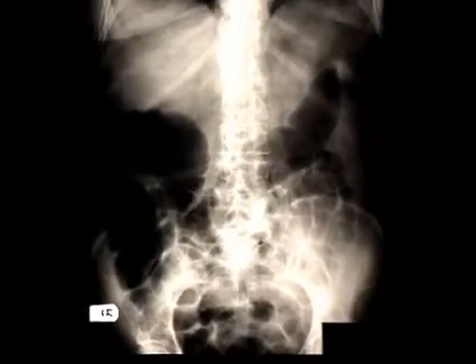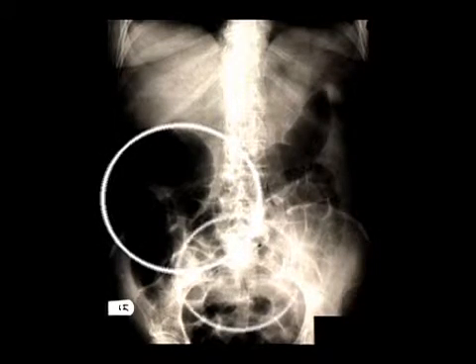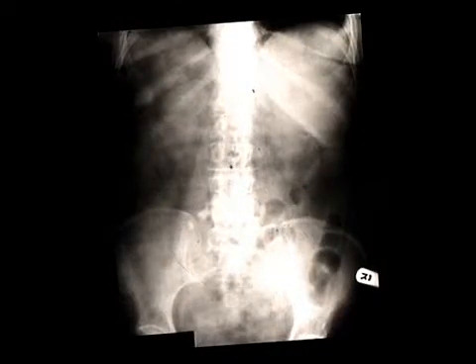Even if the endoscopist remembers to aspirate the colon before finishing, the proximal colon and the ileum will retain air for hours, with after effects for the patient of pain, distension, nausea and flatulence.